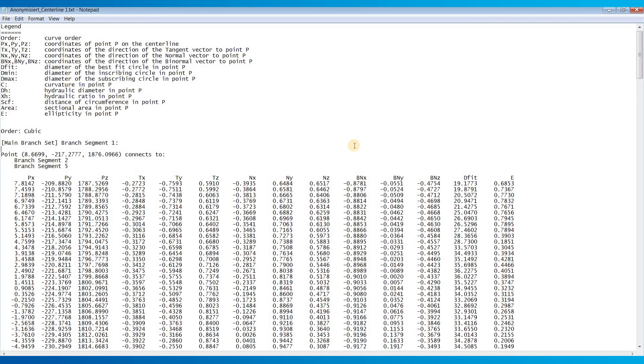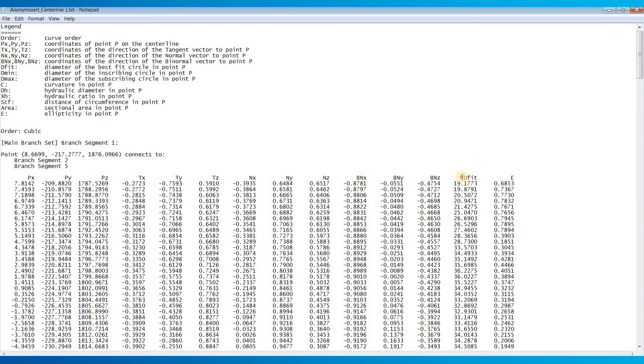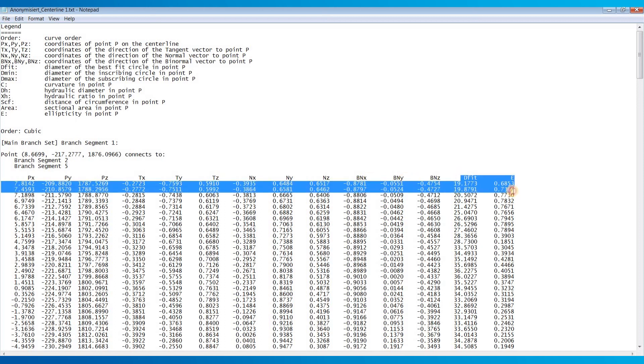So if we open up that text file, this is what it looks like. There's a legend at the top to help you decipher this. And so basically it's just showing the coordinates of each of the control points, the tangent vector of that control point, the normal vector, the binormal vector, and then the last two columns are those two measurements that we exported out, the best fit diameter and the ellipticity.